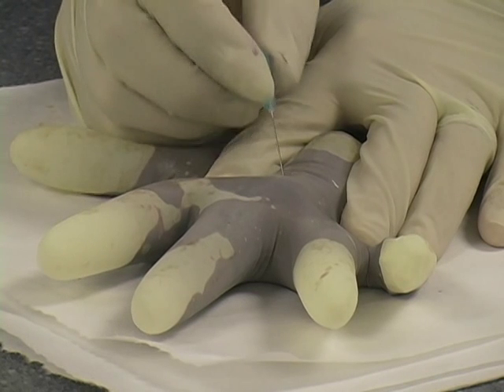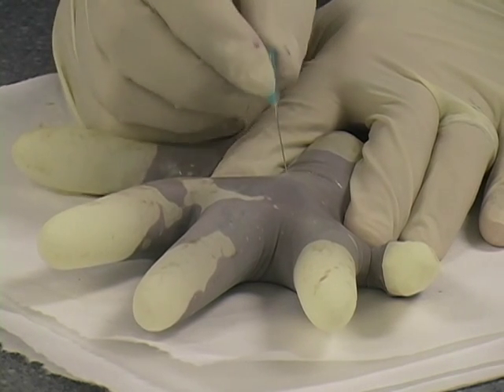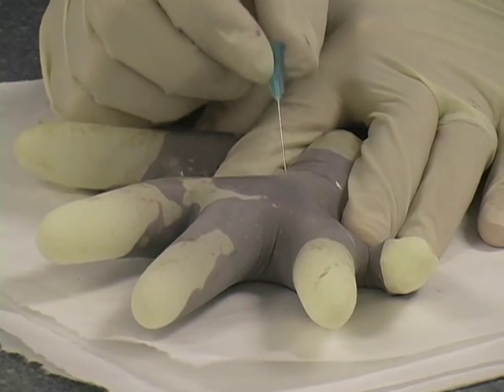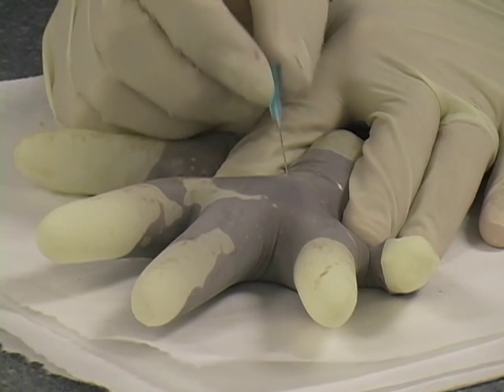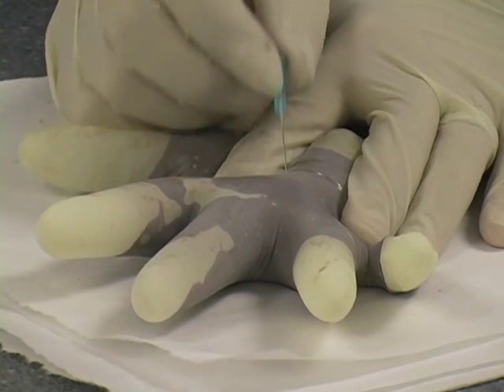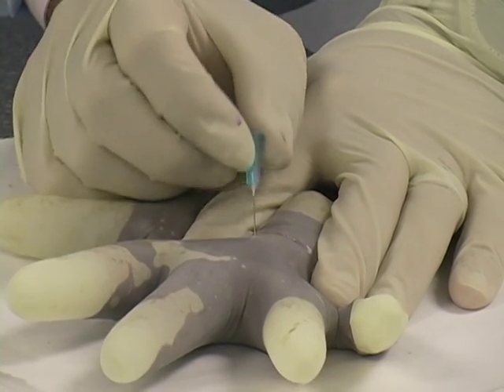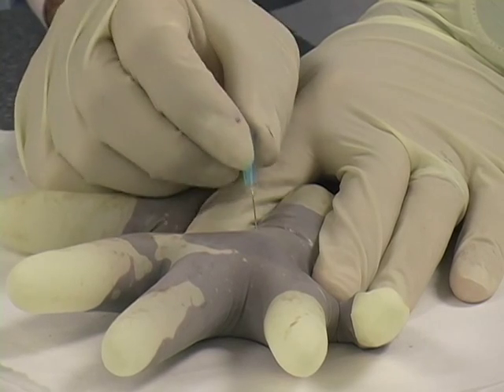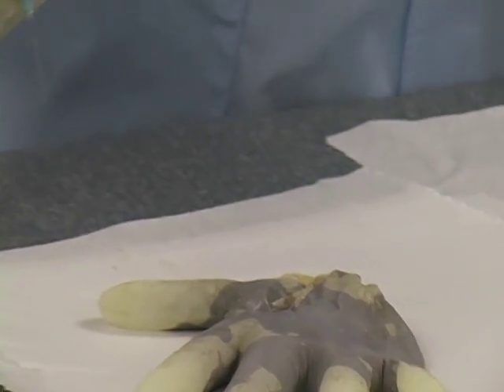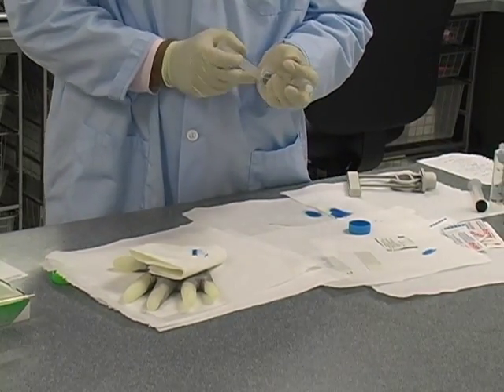Just vigorously move the needle back and forth in and out of the tissue. We're using the motion of going in and out to disrupt the cells and get them up into the hub of the needle and into the needle shaft. You can see how vigorously I'm moving this needle in and out — this is really key, this is what gets good material. When ready to come out, put the gauze down, tell the patient to hold, and in this case we put our plunger in the syringe.